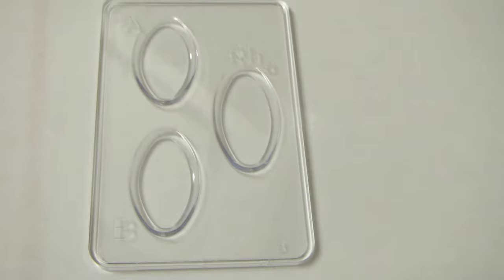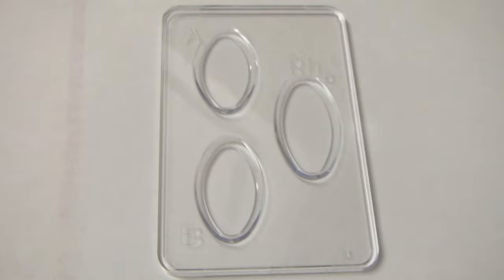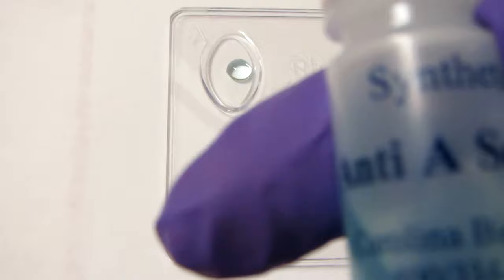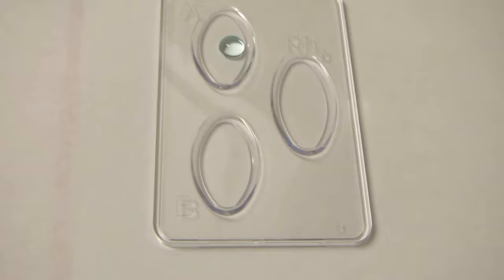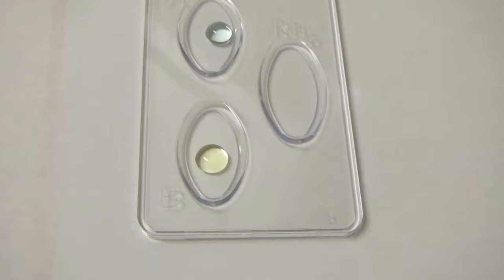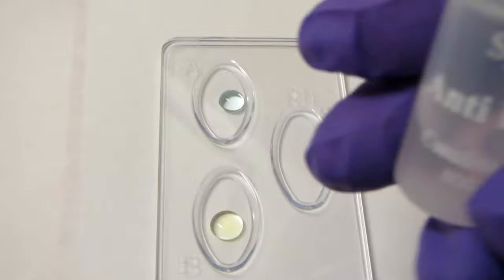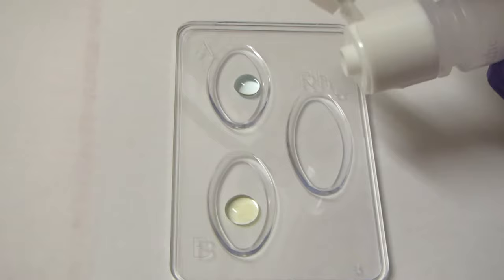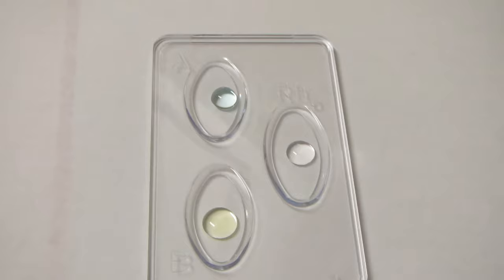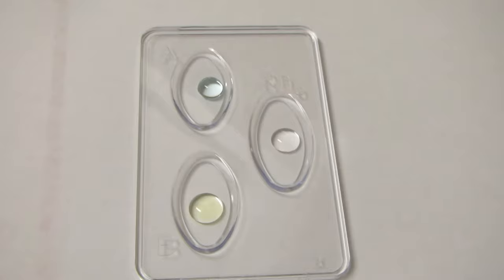We're going to take our anti-A serum and put a drop in the A well. Remember, anti-A means it's going to react against the antigens found in A blood. We take our anti-B serum and put a drop in the B well — that reacts against the antigen found on type B blood cells. Then we've got our anti-D serum; remember, type D is the other name for RH factor. We put a drop in the RH well, and the antibodies in there will react against the RH antigen if it's present on the blood cell.